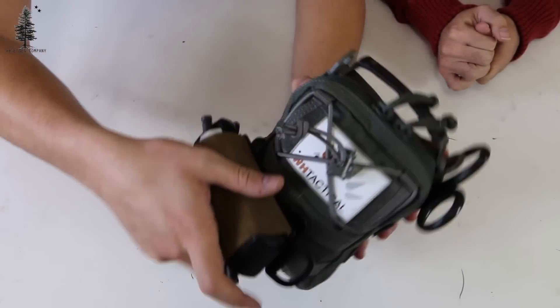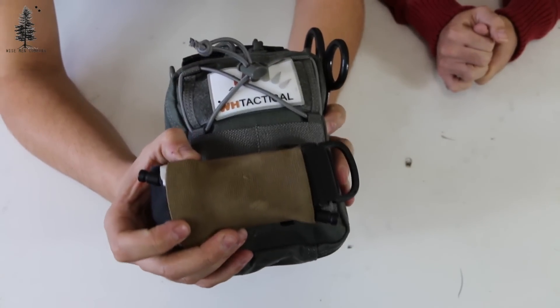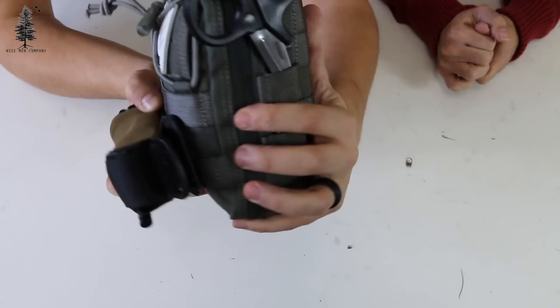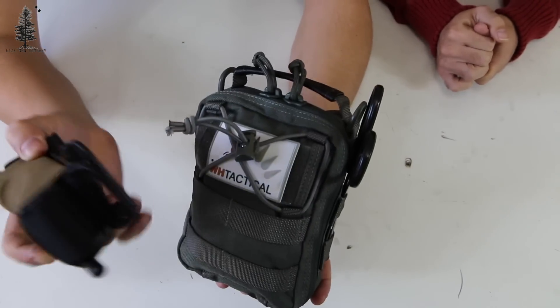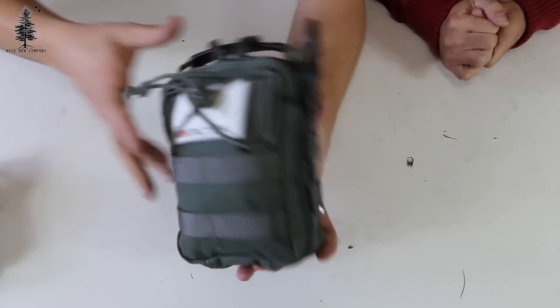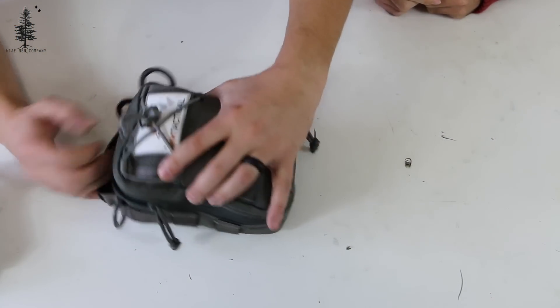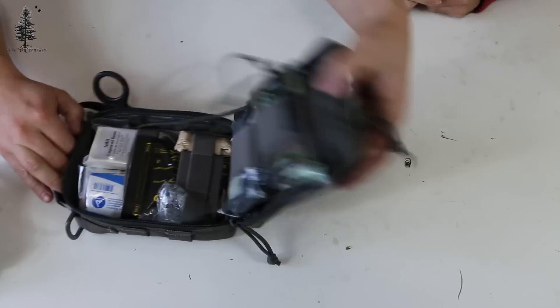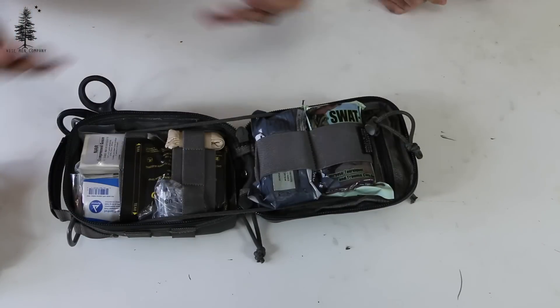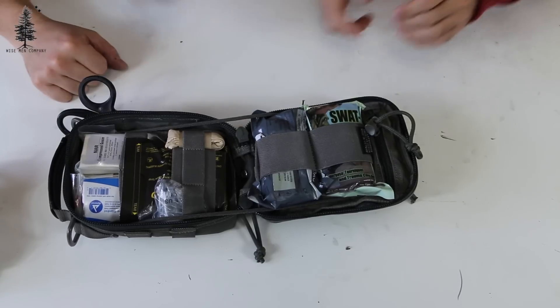I typically run a Lunar Concepts Swift TQ carrier on the outside — fits nicely right in front, just gives me another tourniquet. As you guys know, you probably can't have too many tourniquets in your pack. This does open the full way so you can lay it nice and flat. I always like that in a med kit, but go ahead and get into some of these bits and pieces.